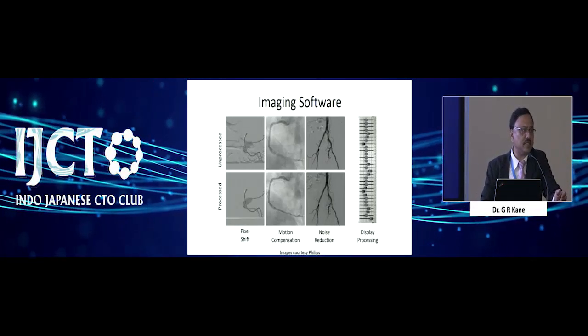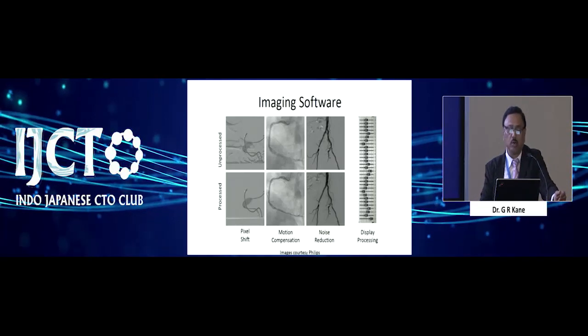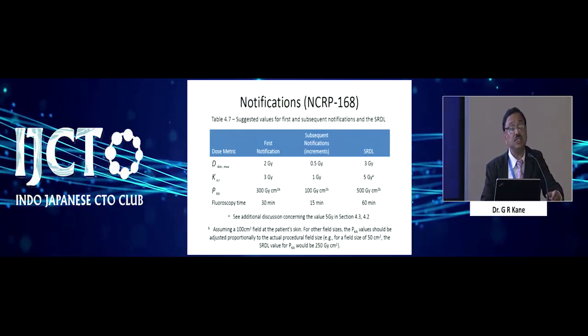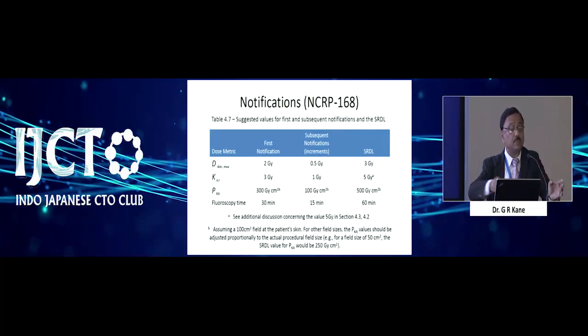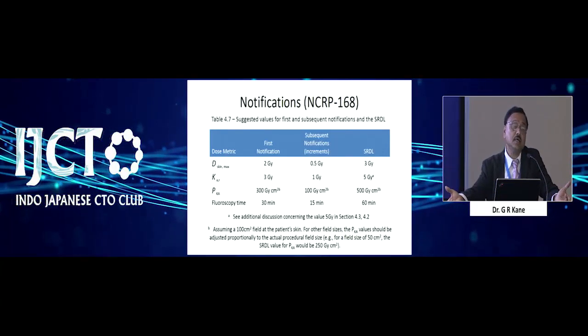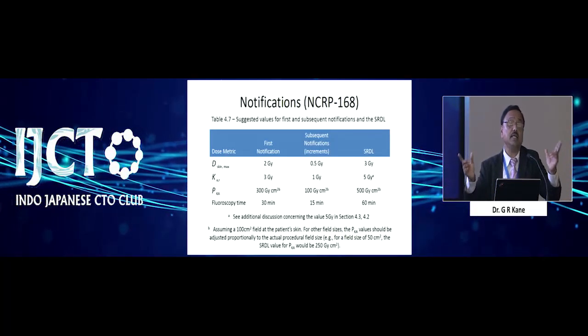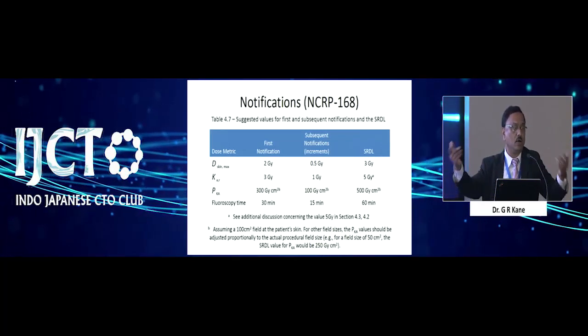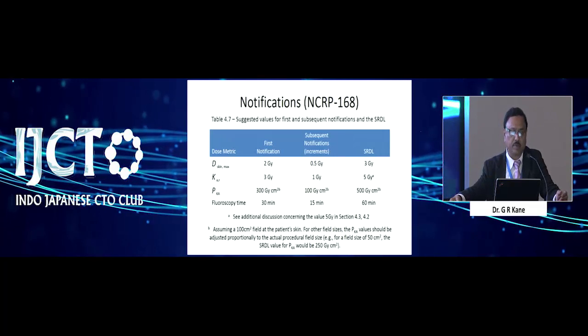You just do the case, press the fluoro, press the cine, and go home saying that you have done a very good case. It is essential that we know as the case progresses how many grays the patient is receiving, because the patient gets the maximum burden. But he will get the burden only once, maybe, if you are doing the procedure. You are getting the burden every day, every procedure that you are doing, reflected from the patient.